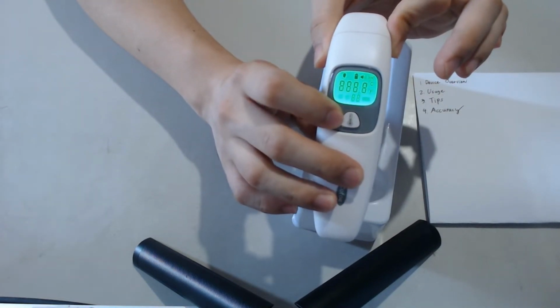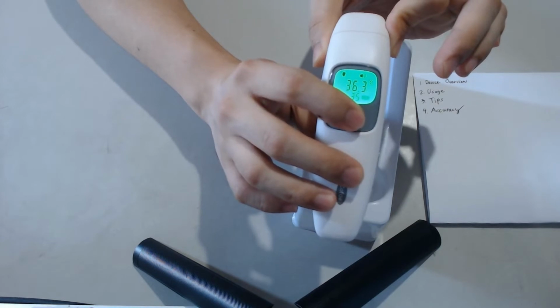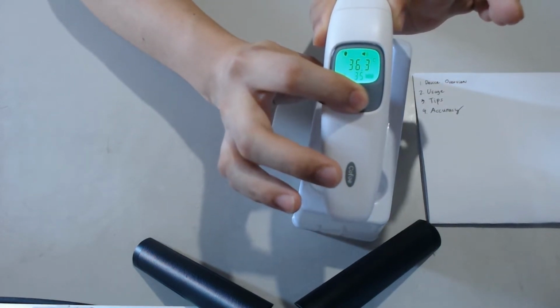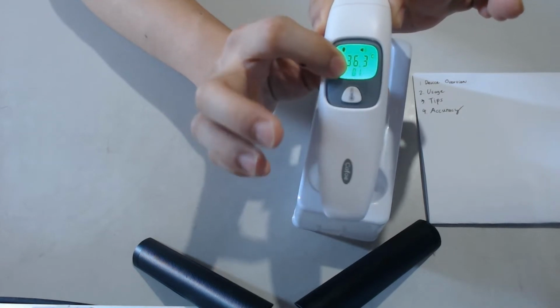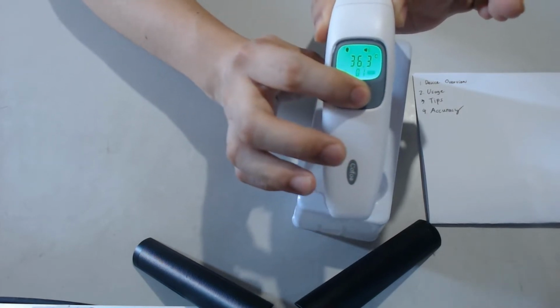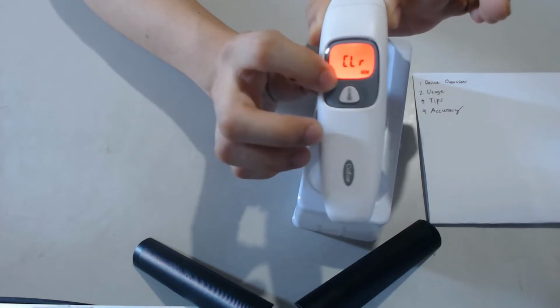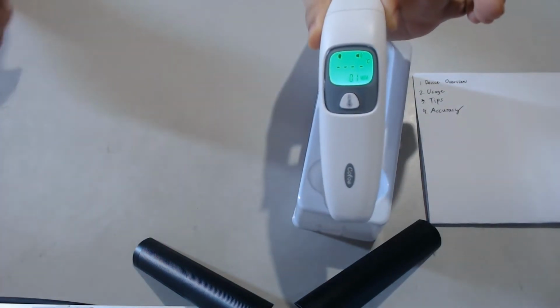So I open this. Then to reset this, simply hold this for 2 seconds to go to memory mode. Then hold for 4 seconds to clear it. See? It's going to clear the memory.